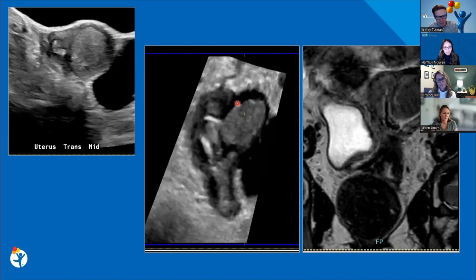I'm curious if you guys have any experience with doing this, or if you have any thoughts on this. I have not done it with just a normal probe. So that's really interesting to know that you can, and I'll probably have to look into if our software allows for it.